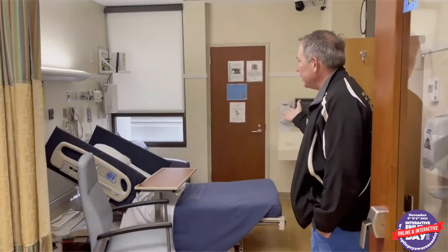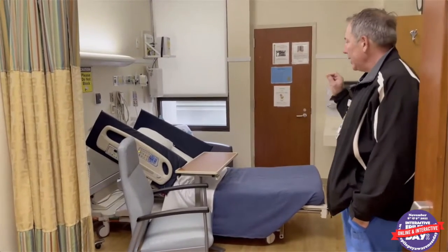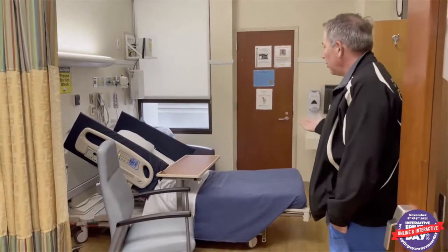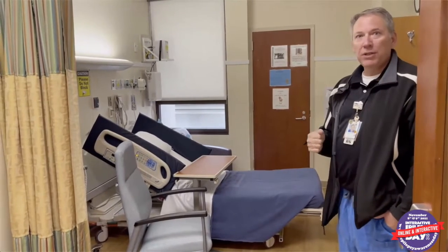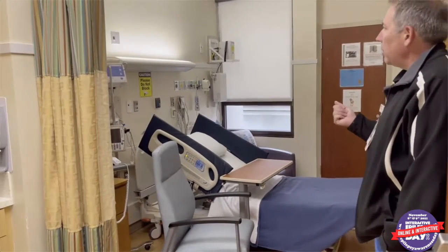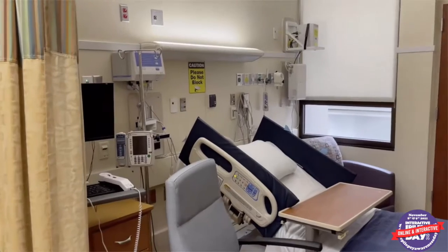So this here is a typical epilepsy monitoring unit room. It has the bed at its lowest setting. Why the lowest setting? Because patients might have an accident, a fall caused from a seizure, or whatever else is happening. We also have padded side rails to prevent injuries, especially during a generalized tonic-clonic seizure. We also have all the equipment used to connect the patient to the EEG.